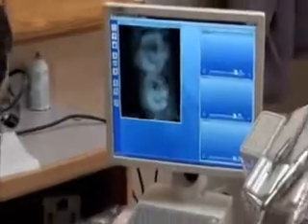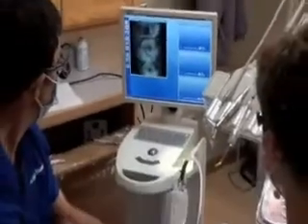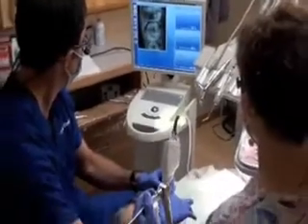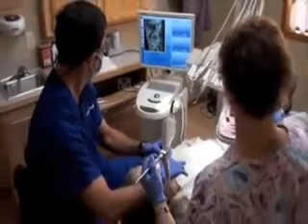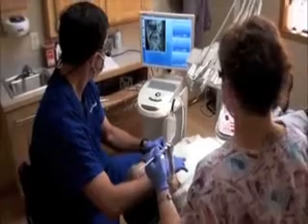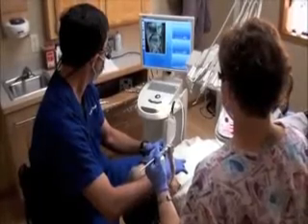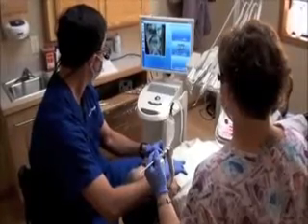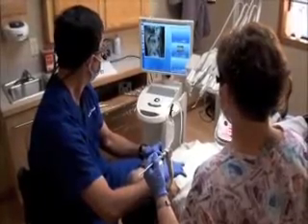An image was taken of her old crown's anatomy after checking to make sure that her bite was perfect. Basically, her existing anatomy was copied, as there was nothing wrong with the shape, contour, and bite of her old crown.